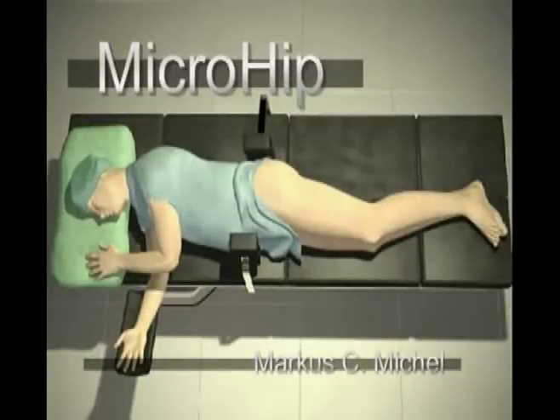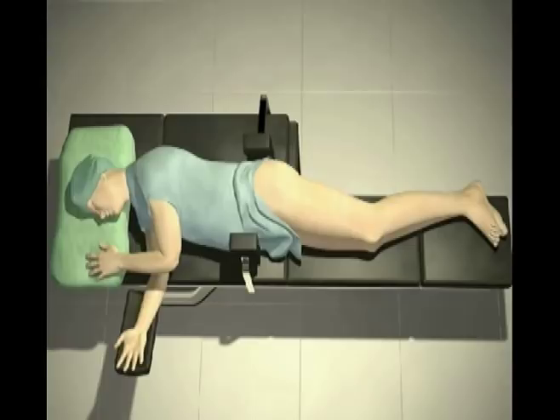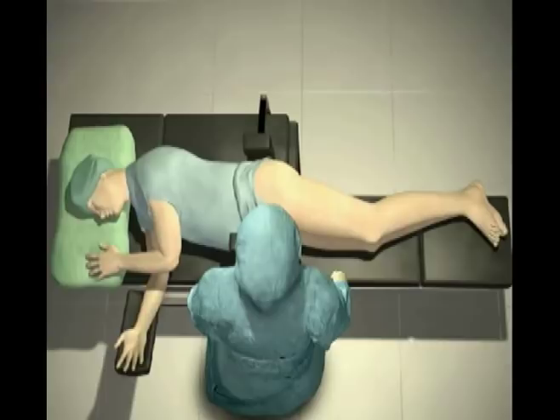One half of the operating table is removed. The patient is positioned on the remaining part of the table as close as possible to the surgeon in a decubitus lateral position. Both knees are slightly flexed and the patient is stabilised with support to the symphysis and to the sacrum. The surgeon is positioned ventral to the patient.